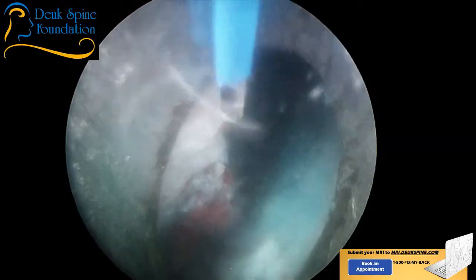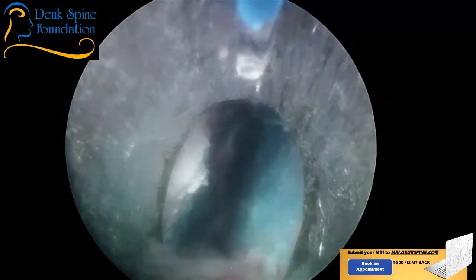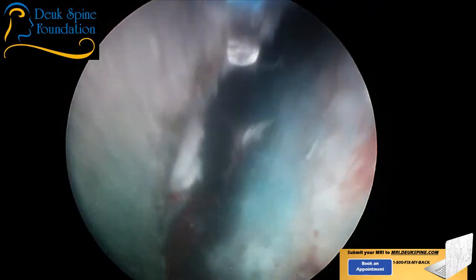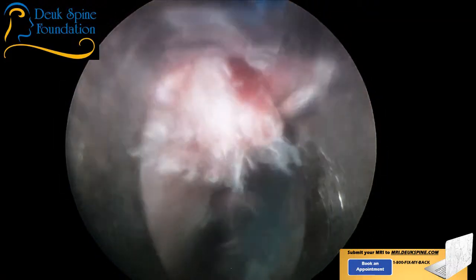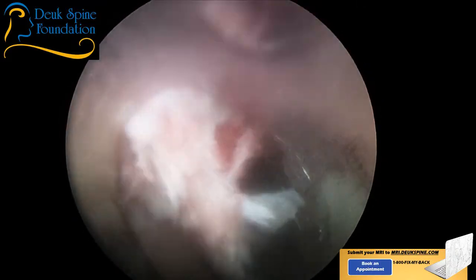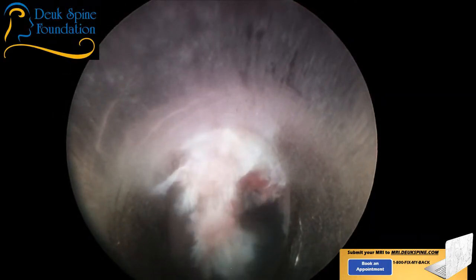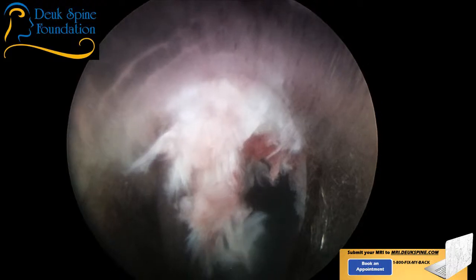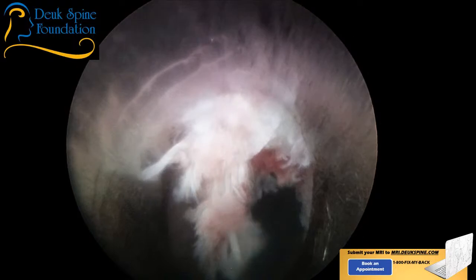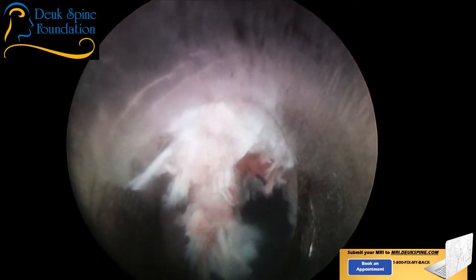So there's a lot of bubbles still. Okay? All right. It's actually more scar tissue than bone spur. But there's definitely a bone spur there. It's just not big. So I'm coming. There it is. That's what I came for. Right there. Okay? I love it. So beautiful. So, all the scoliosis, collapsed disc, facet arthropathy, hypertrophy, deformity, herniated disc, degenerated disc, everything. It all boils down to this one little monster right here.